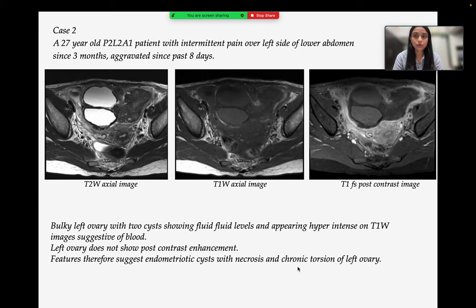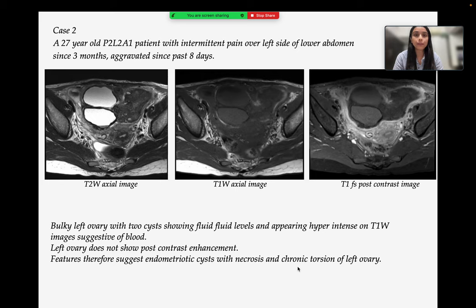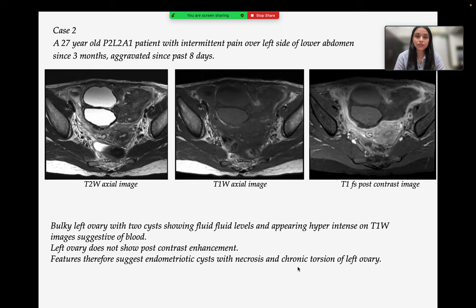Case 2 is a 27-year-old P2L2A1 patient with intermittent pain over the left side of the lower abdomen since 3 months, aggravated over the past 8 days. The images show a bulky left ovary with two cysts showing fluid-fluid levels and appearing hyperintense on T1, suggesting the presence of blood. The left ovary does not show post-contrast enhancement, and features suggest endometriotic cyst with necrosis and chronic torsion of the left ovary.